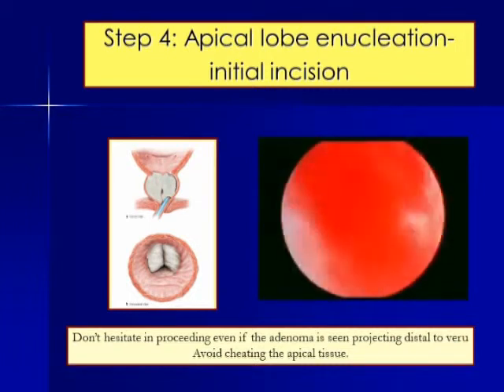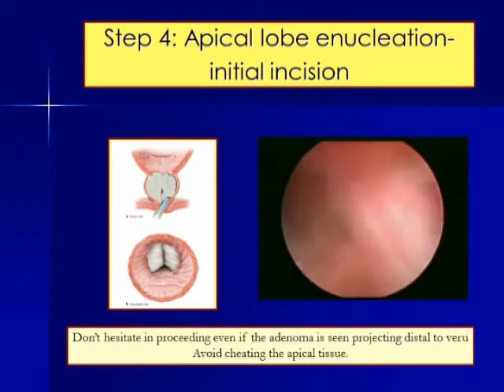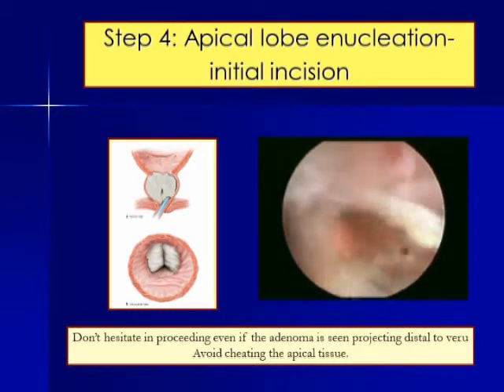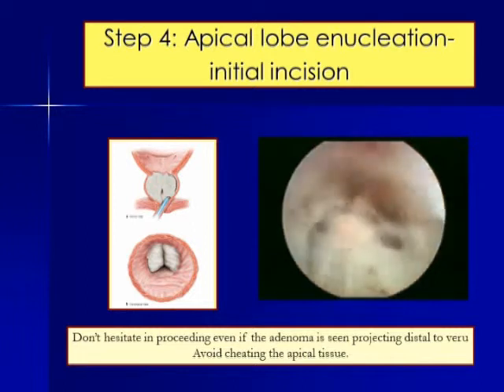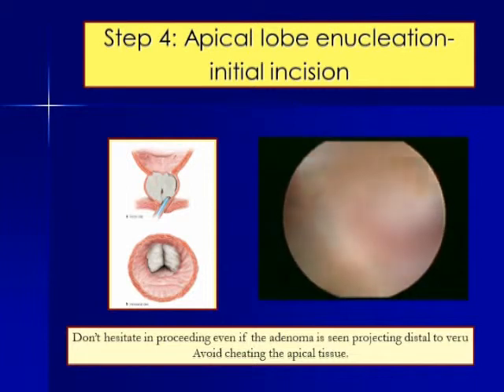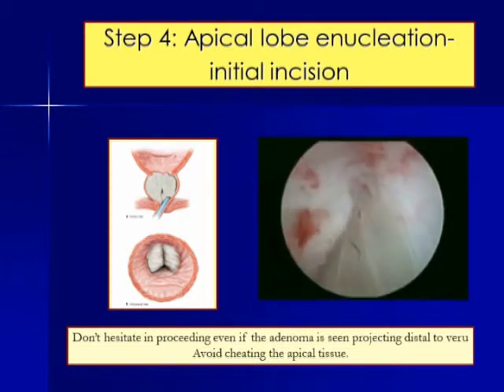The groove which exists between the apical tissue and the veru has to be deepened. There is always some oozing and bleeding in this area because of the submucosal vasculature, which has to be ignored. Once we cut the mucosa, usually we can go into the capsular plane with 1 or 2 cuts, and once we enter that proper plane, then a blunt dissection, as you can see here, will gradually separate the adenoma from the capsule. The vessels which will be encountered can be taken care of by defocusing the laser beam. This is how we are peeling it off with the mechanical dissection.